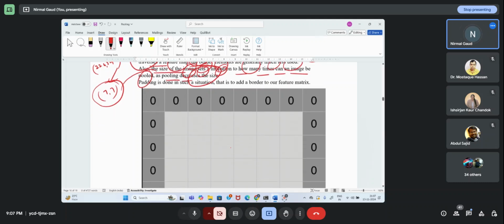The final tensor you are getting is 7, 7, 2048. If you have one image, you put one, and if you have 1000 images, then you put 1000 here. Yesterday only I explained this. This is your number of samples, or number of images. This is width, this is height, and this is the depth of the channel.